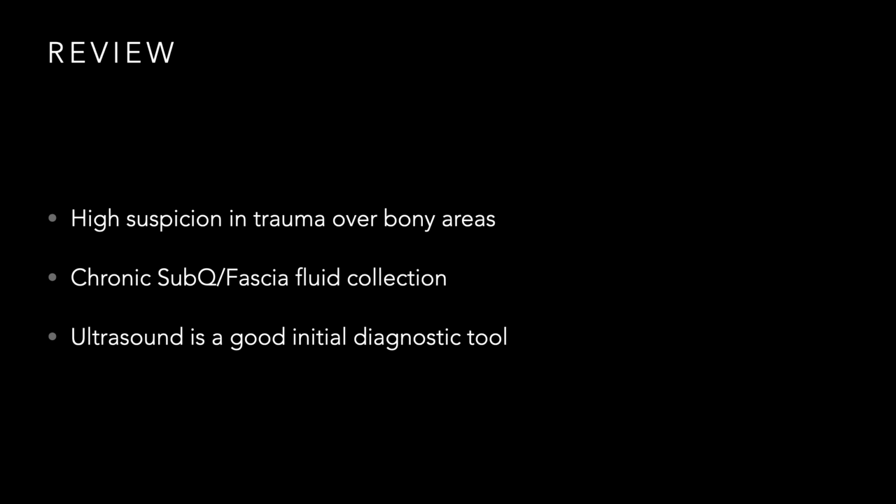Or when you happen to be scanning and see this lesion, like, hey, I got fluid between the subcutaneous and the fascia, and I have this trauma history, well, this is what I'm dealing with, and these are the next steps I need to do. I need to get surgery on board, probably will eventually get some cross-sectional imaging, and then what should I expect in terms of management? Well, depends, but it could range from ice and compression all the way up to, hey, we'll take this patient and get this thing drained out.